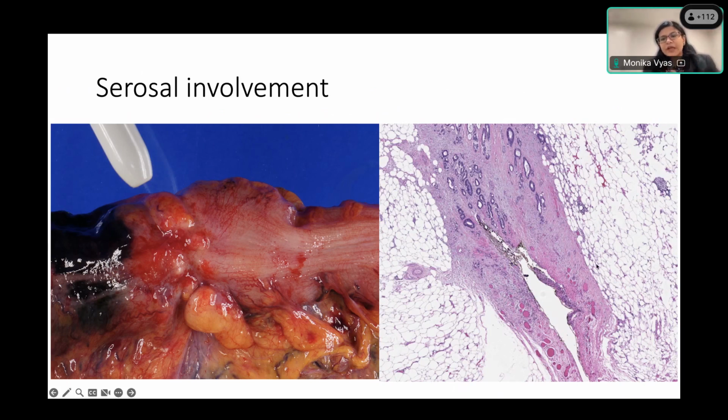And then this is an example of what I was talking about. This is just a little area where the serosa is diving down, and the tumor is involving the serosa in that part. Having ink on this area can help a lot, because sometimes what happens is the tumor is destroying the serosa. There's a lot of inflammation, and if you don't have the ink, you are not able to decide if that is the true edge of the tissue or not. Having ink there is really helpful.